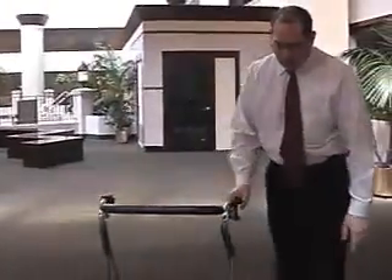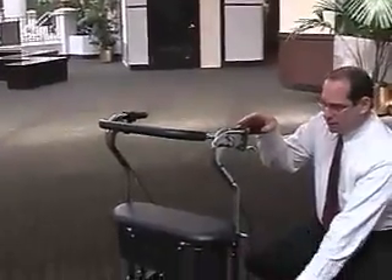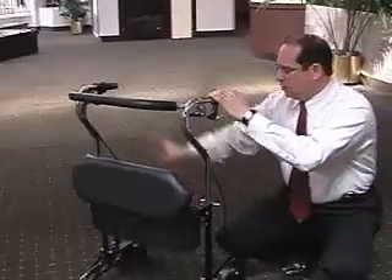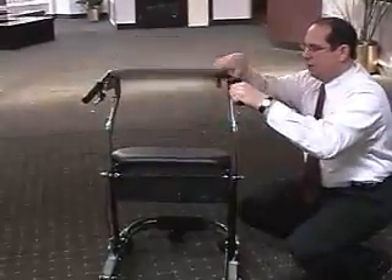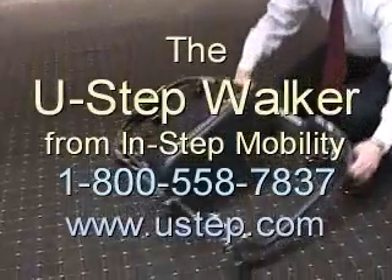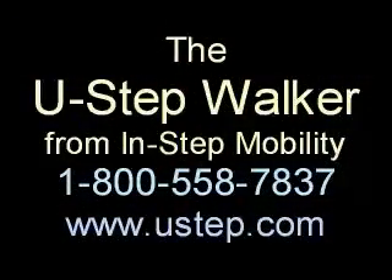The unit is of course height adjustable. This standard unit is adjustable from five feet to six foot one, and we do make smaller and taller units. The unit also folds nicely for transport — just release these two levers here and the unit will fold right up just like this. It fits in the back seat or trunk of the car.